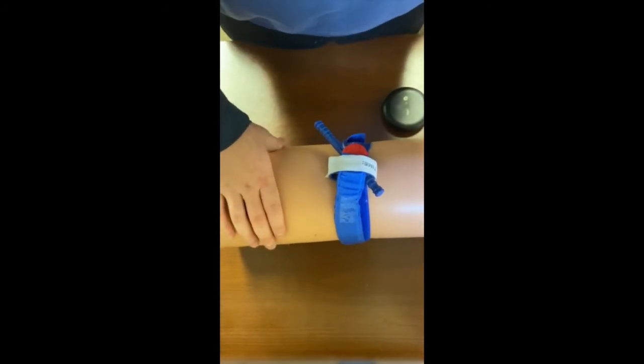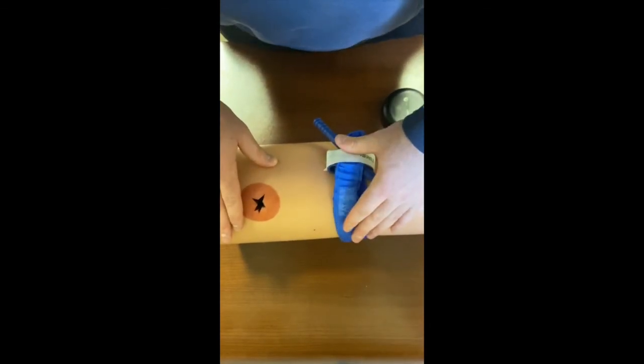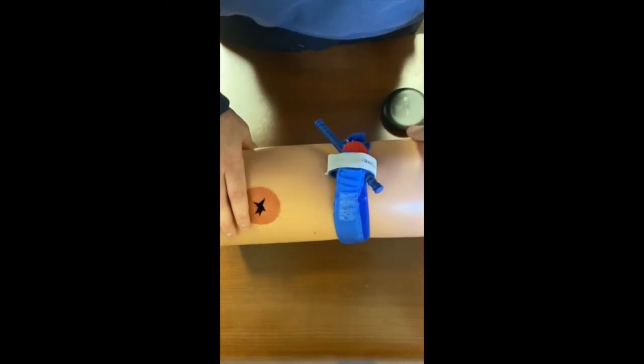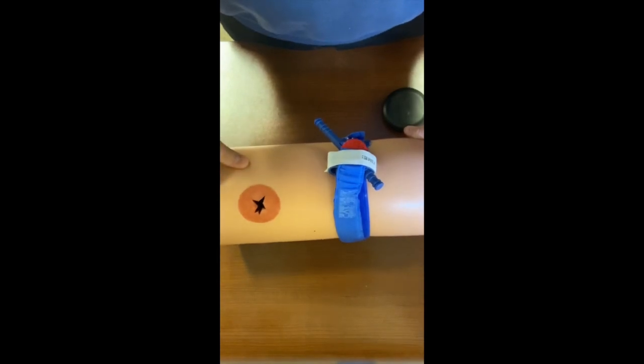If the tourniquet is not tight enough, you'll know because it's going to continue to bleed. So we're going to make sure that that bleeding is effectively stopped. If it doesn't, we're not going to take the tourniquet off ever. We're going to apply another one that's above this. A key is that you do not want to take the tourniquet off because that will just allow all the blood right back out. It's a very simple tool to use, and it is very effective in saving lives.